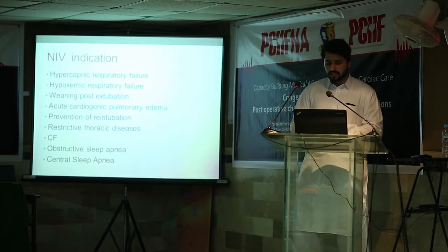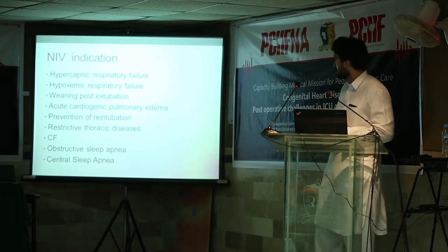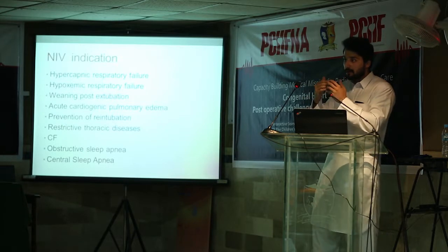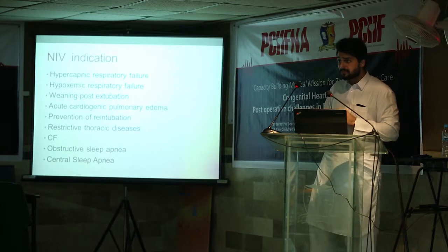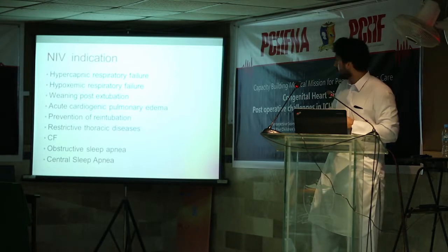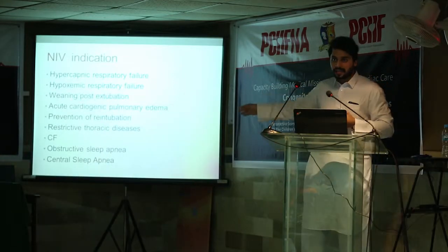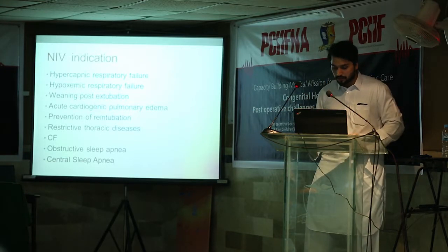What are some indications for NIV? Hypercapnic respiratory failure, hypoxemic respiratory failure, and weaning post extubation, so we can extubate directly. We can make extubation faster with NIV rather than waiting. Do you know the difference between hypercapnic and hypoxemic respiratory failure? They are the two types: one because of CO2, one because of O2. Also restrictive thoracic diseases, cystic fibrosis, OSA and CSA. This is for the long term. For OSA and CSA, NIV is very important.